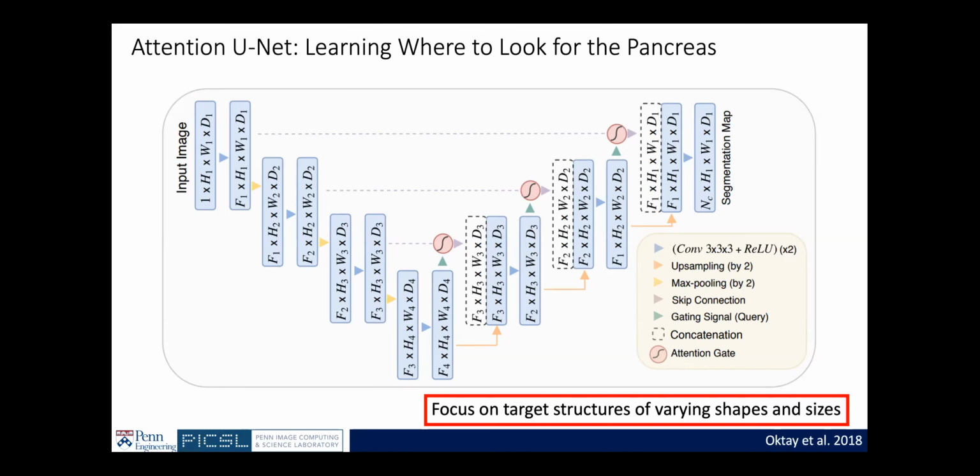We already know that dot products are used to compare similarity between two different vectors. So if you compute a dot product, or add these two things up, it can tell you where to look in that particular image for a given segmentation region. I'll show a picture, it will make it more clear.